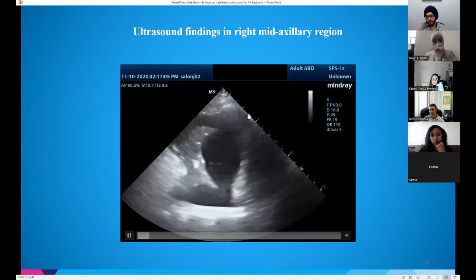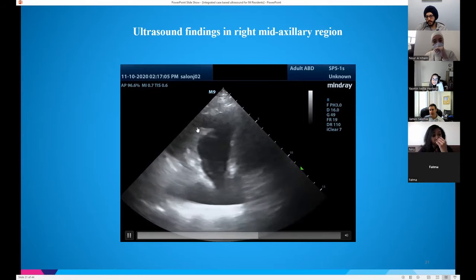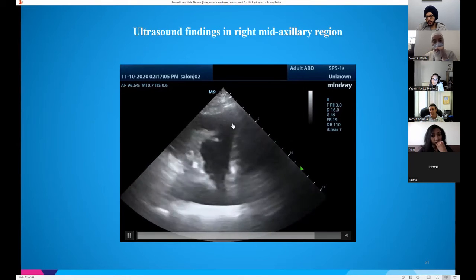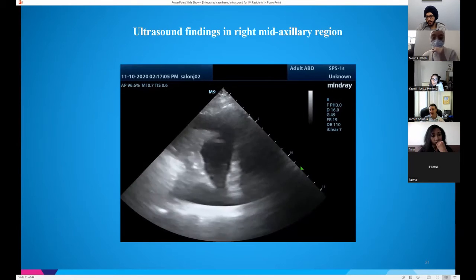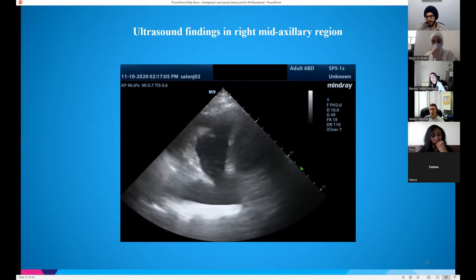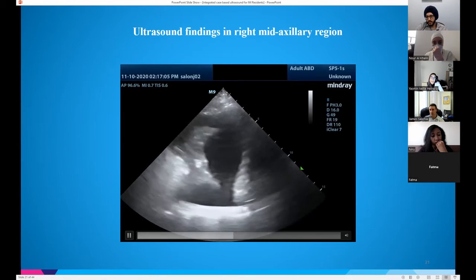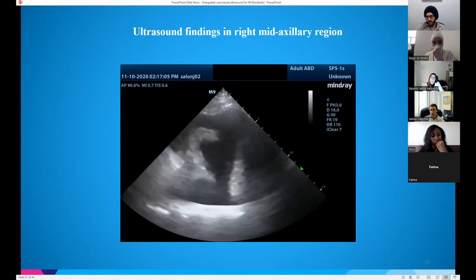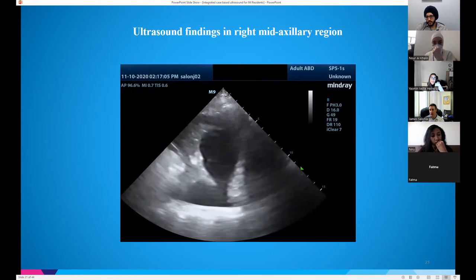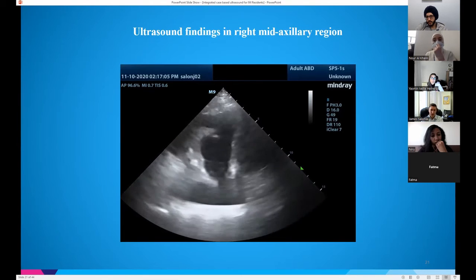And then maybe 3, 4 to 5 centimeters before I hit something dangerous. So I have a very, very small window. So you want to go in at least 2.5 centimeters, but you certainly don't want to go up to 5 centimeters because then you know you're going to hit something problematic. So a very narrow window. And if you were doing something like a thora on a patient like this, you'd want to pay particular attention to how deep you're in and how many centimeters you're going in. Otherwise, you're going to cause a lot more problems than good.